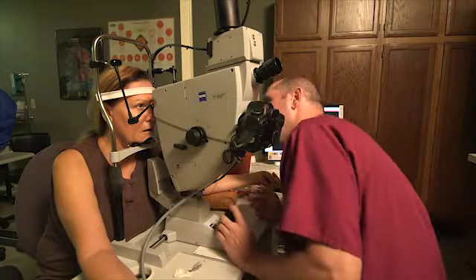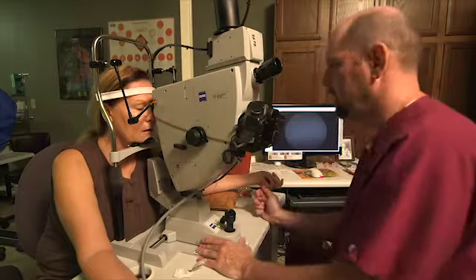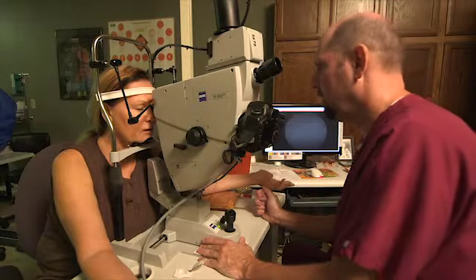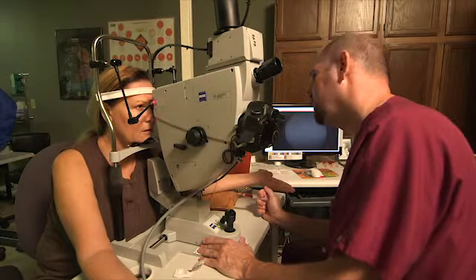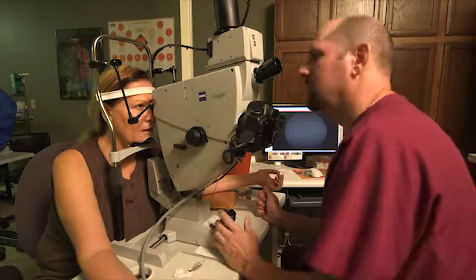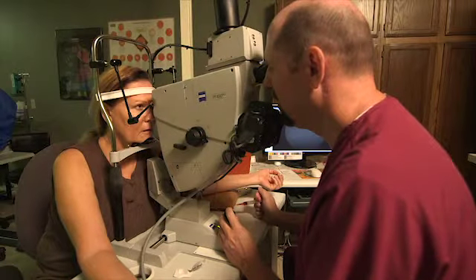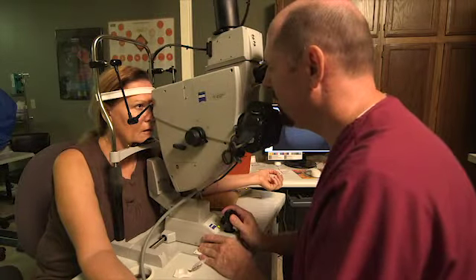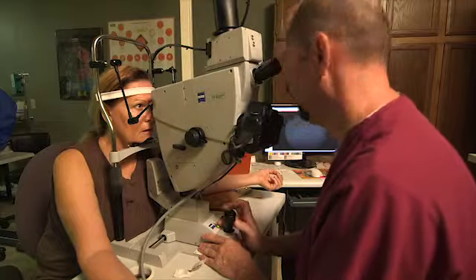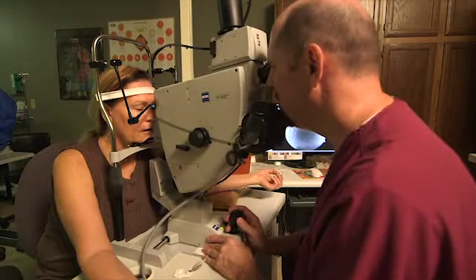An orange-colored dye called sodium fluorescein is injected into a vein, either in the hand or the forearm. The dye is not like iodine-based dyes used for contrast studies of the kidney and heart. Dye travels to the eye where retinal blood vessels are visible through a pupil already dilated with drops.